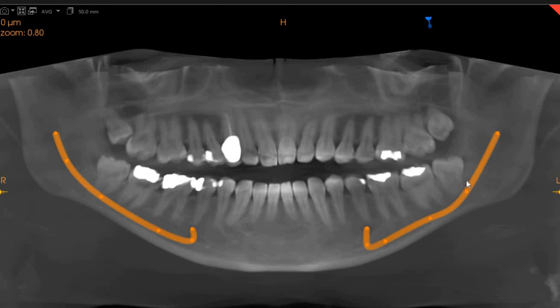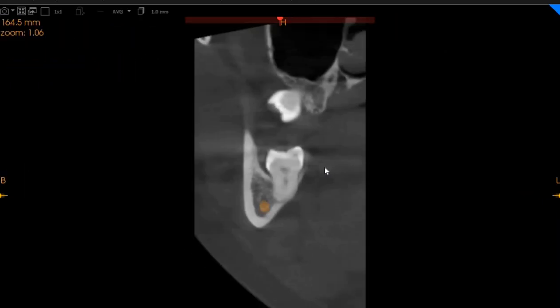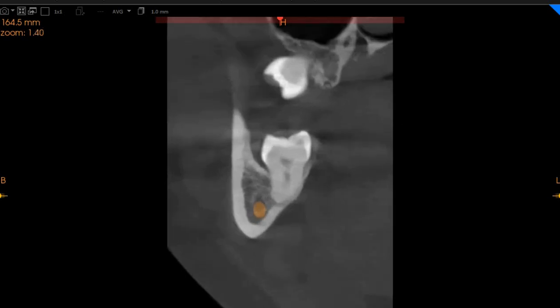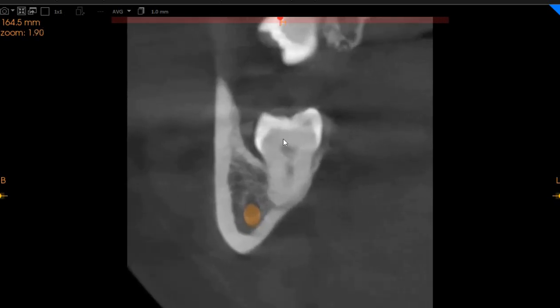On the panoramic view you can see the inferior alveolar nerve is very closely associated, but on the trans-axial view you will be able to see that the inferior alveolar nerve is much more buccal than the wisdom tooth, which is placed lingually. I'm going to zoom in for the doctors so that they can see more clearly.